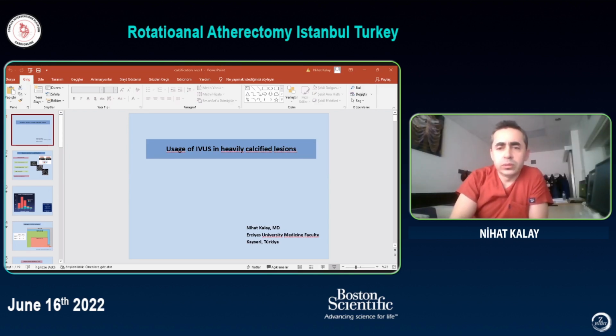My talk is on use of the IVUS in calcified lesion. Coronary calcification is the major challenge during PCI for all interventional cardiologists. It is related to suboptimal PCI. From the study, we know that suboptimal PCI is closely related to stent failure at 1 year and the following years.